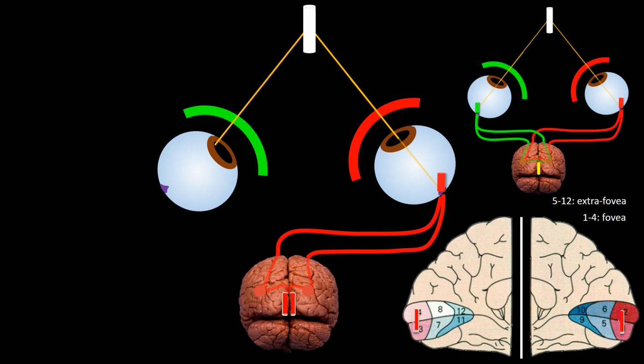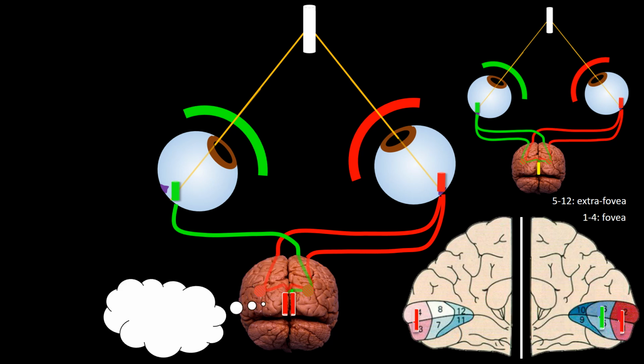The white bar will also be viewed by the affected left eye through the green crystal, but since abduction is faulty and adduction prevails, the image will fall in the nasal retina, outside the fovea macular area, as shown here. I have now represented the optic fibers from the nasal retina, bringing the information to the mesial region of the right hemisphere, as illustrated here and here. Now the brain does its magic as best it can and produces two cortical images, the red one in the correct location, the true image, and the green one, the false image, not in the correct location.